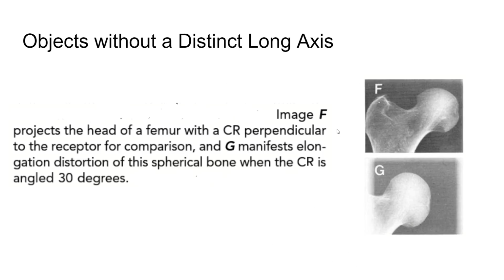And maybe this is the most important slide of the day, because in clinic, I see this all the time, right? Have you learned hip yet? Right? So you think you might be doing the right thing. You turn the hip in and, provided there's no fracture, you broaden the hip and all that good stuff. But if your image has no neck to it, how are you going to see a femoral neck fracture? This is a diagnosis that gets missed a lot of times, right?